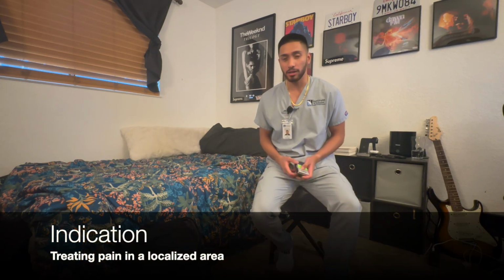So, like I just mentioned, it's mainly to treat pain in local areas. Maybe it's because of brain signals just sending off pain receptor signals where we're perceiving these pain areas in patients, ourselves, whoever it is. So we're going to use an electrical stimulation device just like this to send electrical signals towards the brain to reduce those pain signals. That can be either through gate control theory, opiate release, or descending pain theory. We'll touch more about that when we're setting up the device and showing you different parameters.